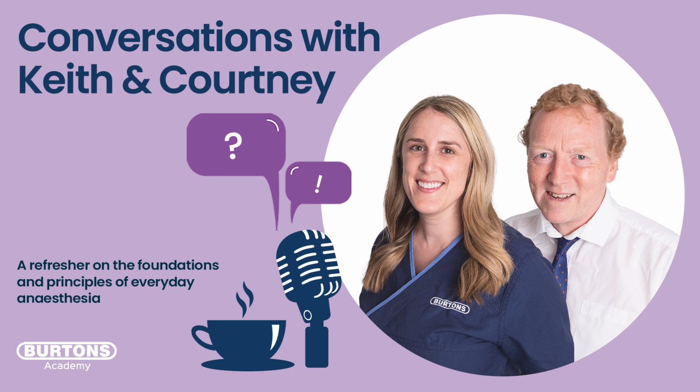The transmission is the typical one, through the tissue. So you have a clip type that has a light on one side and a sensor on the other, and it transmits two different light sources, different wavelengths, through the tissue, picked up on the other side, and it analyzes the difference in the absorption between those two wavelengths. It's going from one side to the other.